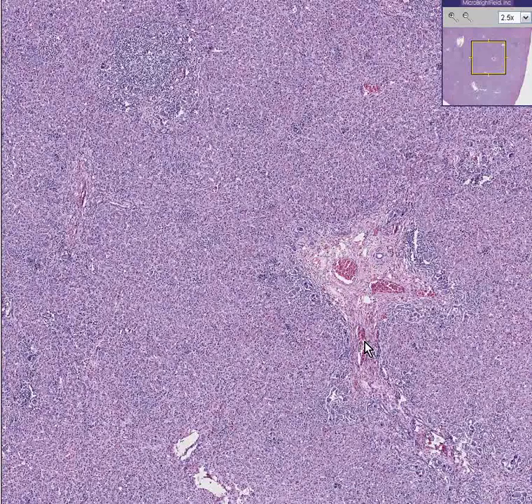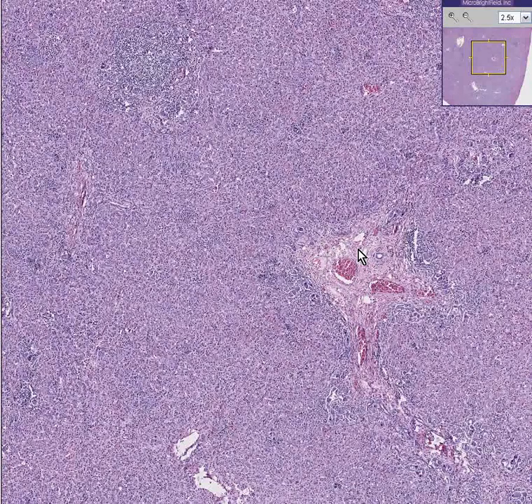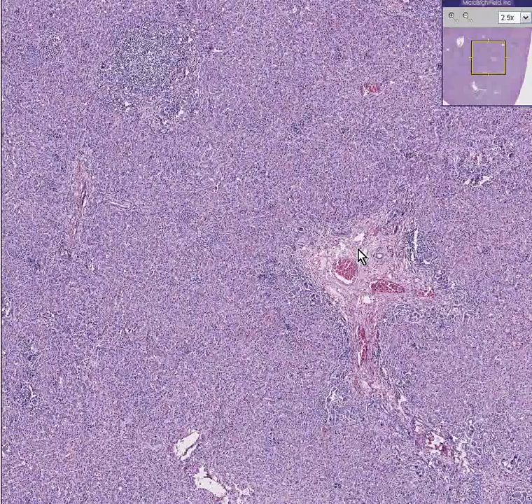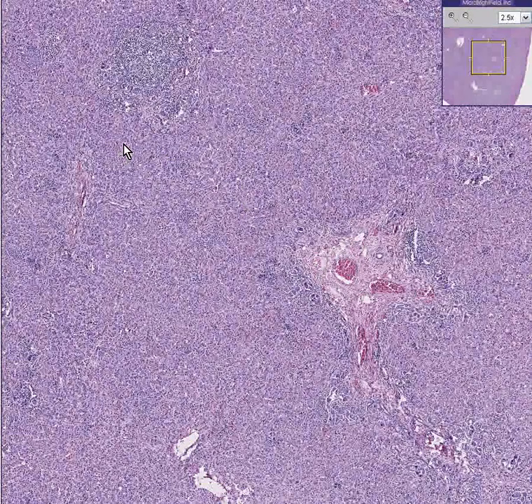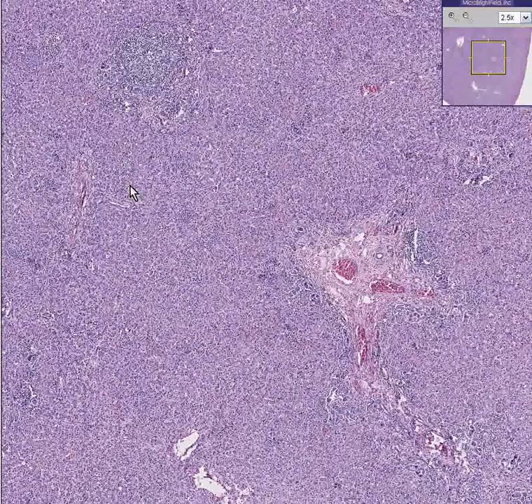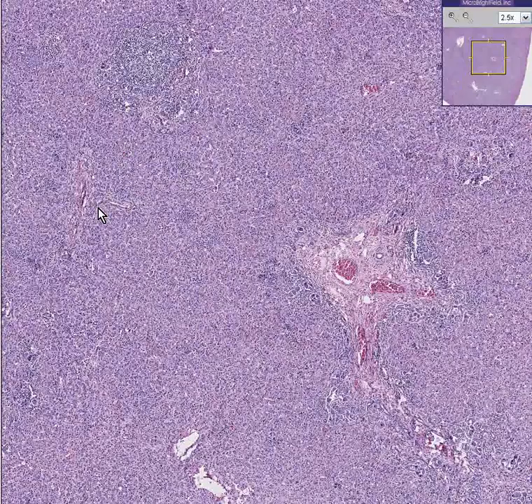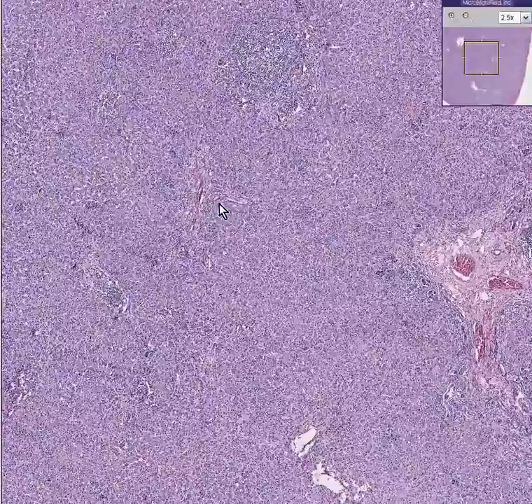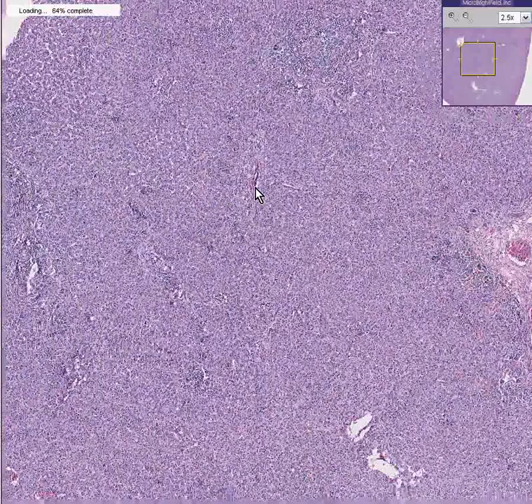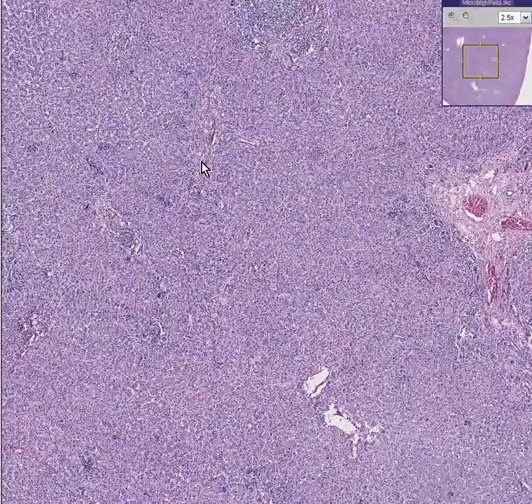Another thing you will recognize is that this is mature fibrous tissue — which it is, because it's a large portal area — but you do not see much mature fibrous tissue within the liver forming nodules. So it's not cirrhosis, but it is a whopping hepatitis, isn't it.